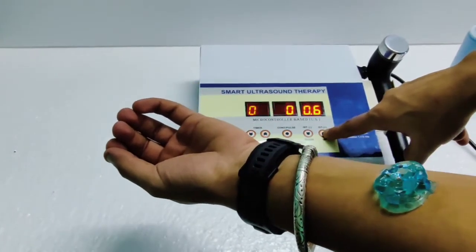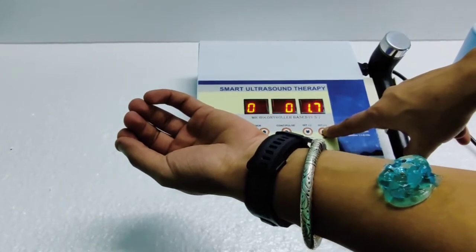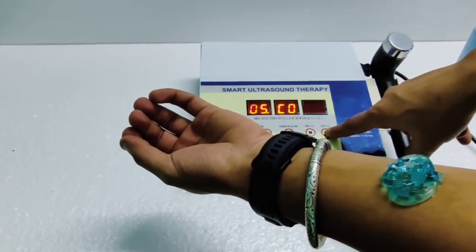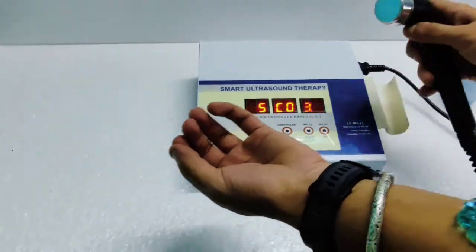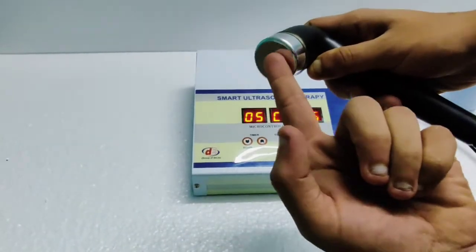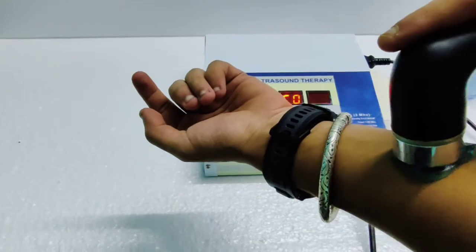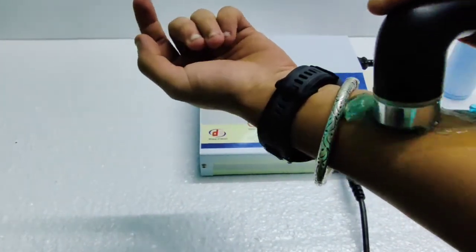We are going to use it on full. Now the head started heating up this area, so you have to put the ultrasound head here and do it like this.